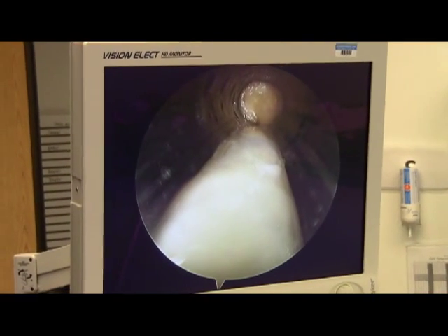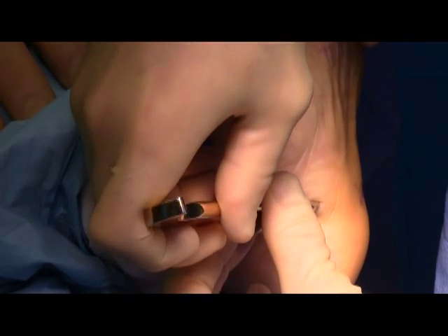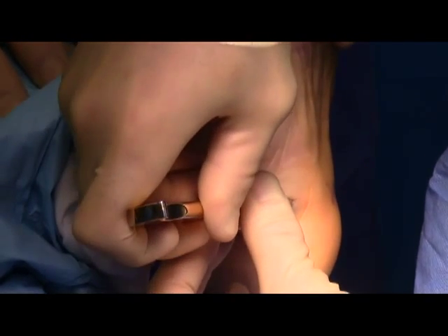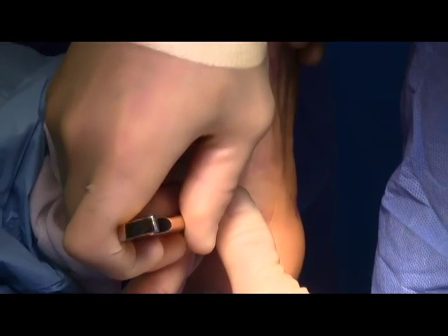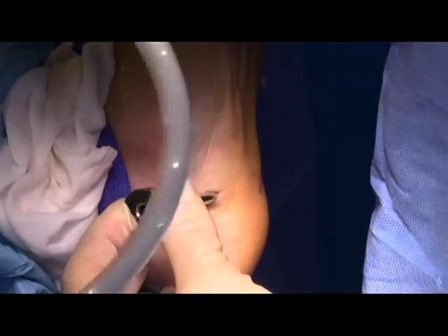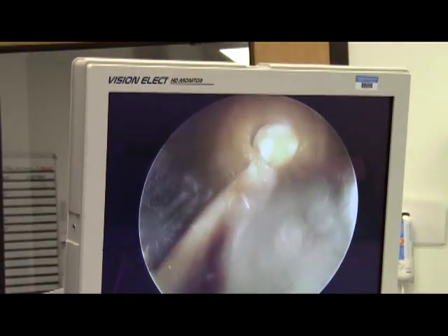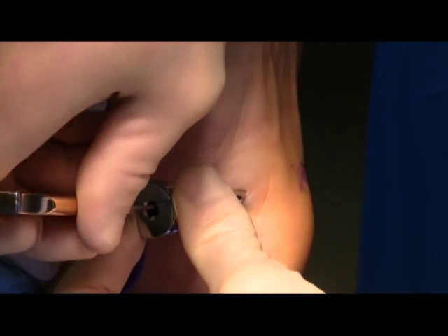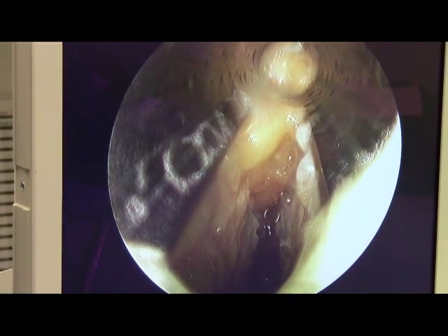That's the plantar fascia, intact. This is a transected medial band of the plantar fascia, and you can see the first layer of muscle bellies, which are the red structures, deep to the plantar fascia.